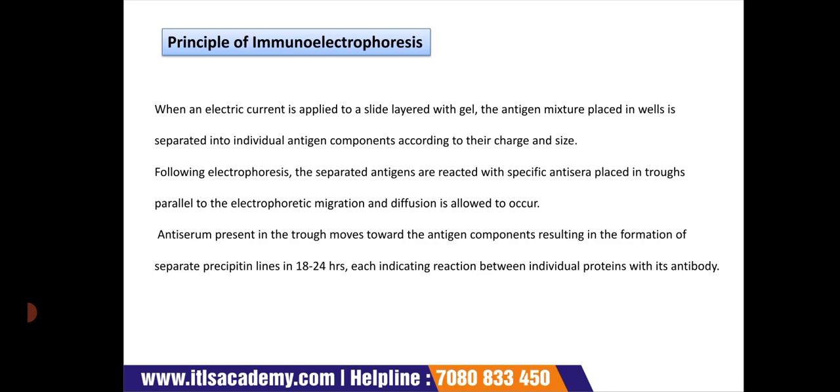Basically it requires an electric current, meaning whenever the electric current is applied to the slide layered with a gel, the antigen mixture placed in the well gets separated into individual antigen components according to their charge. So you must be aware of this principle.